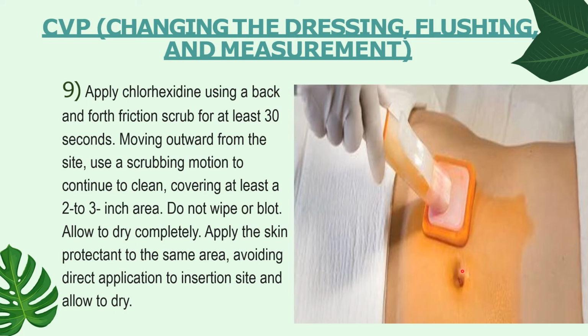So this is the site. Okay, this is the insertion site. For example, this is the insertion site. So in this example, the catheter is not here because I'm just showing you an example of an insertion site. Okay, do not wipe or blot. Okay, allow to dry completely. Apply the skin protectant to the same area, avoiding direct application to insertion site and allow to dry, just on the sides.